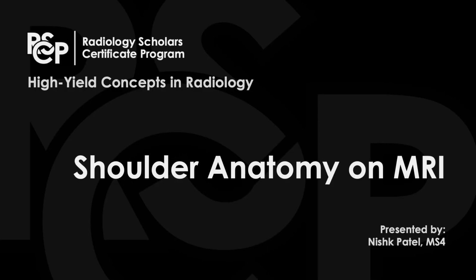Welcome to the Radiology Scholars High Yield Concepts in Radiology video on the shoulder MRI. In this video, we're going to start off by discussing the shoulder anatomy on MRI.